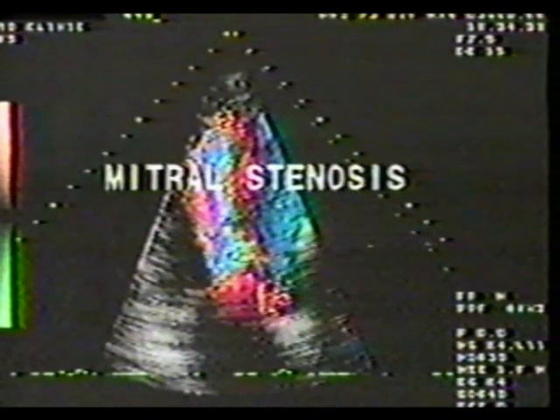On this tape, we will present to you a practical approach of 2D, Doppler, and flow imaging in the diagnosis and assessment of patients with mitral valvular abnormalities. We will begin with mitral stenosis.